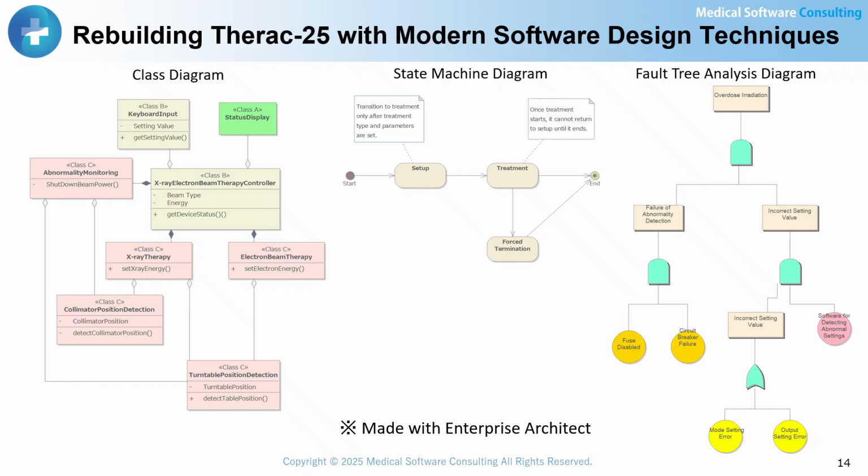However, because software is invisible from the outside, systems with the same external behavior could still suffer from the same flaws as those built 40 years ago, depending on the design philosophy. This is why ISO 14971 Risk Management, IEC 62304 Safety Classification, and rigorous design and verification requirements are indispensable in medical device software development.